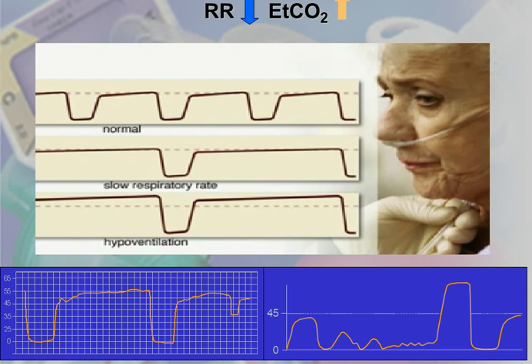So if we decrease our respiratory rate, this would be like our cardiac arrest patients, or our overdose patients, any overdose patient from like heroin or a sedative. The slower the respiratory rate, the higher the end-tidal CO2 is going to be, because they're retaining all that carbon dioxide.